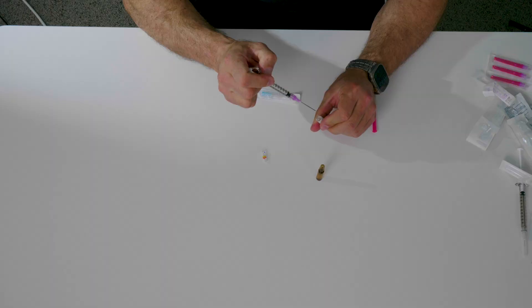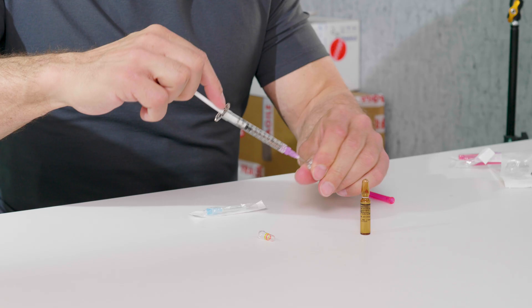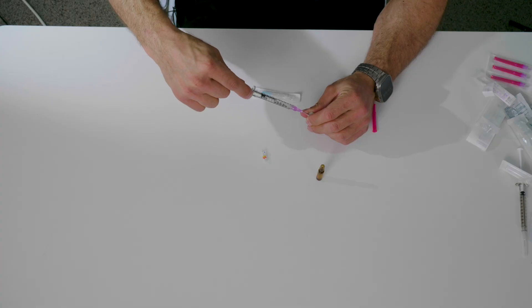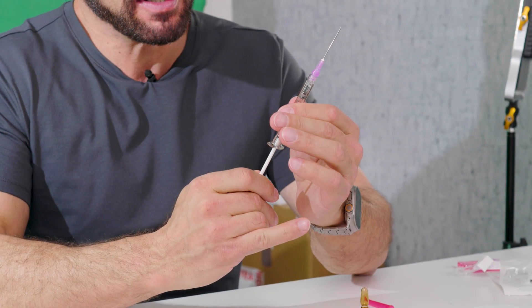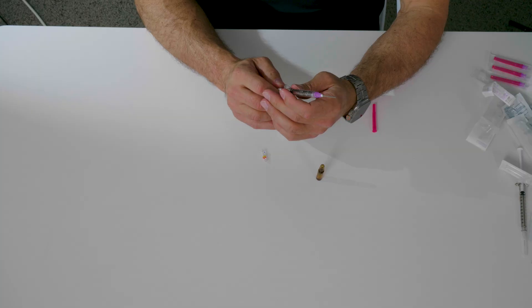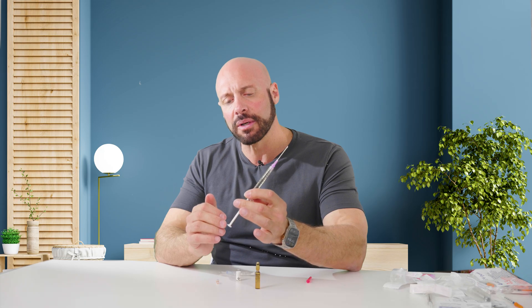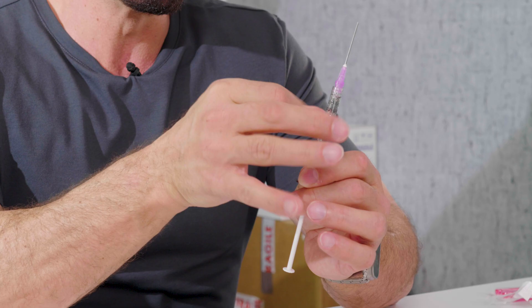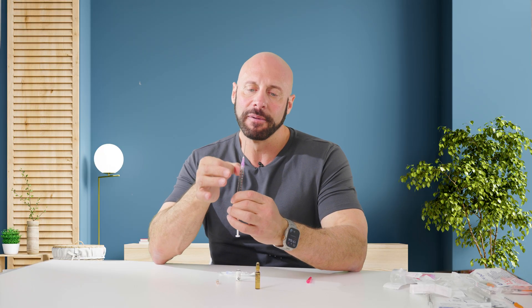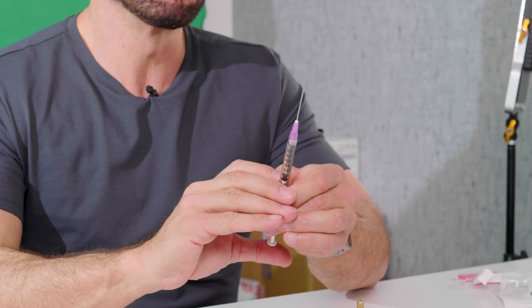Then I tip the needle into the ampule and start pulling back on the plunger. My aim is to fill it halfway — about half a milliliter. Then I pause. I pull back on the plunger until it hits the bottom. Be careful: you can pull the plunger out, which would compromise sterility — so don't pull it all the way out but hold it towards the bottom. I'll use one of my fingers to hold it against the side of the syringe, and then I flick the syringe to remove all the bubbles until I've got one big bubble together.